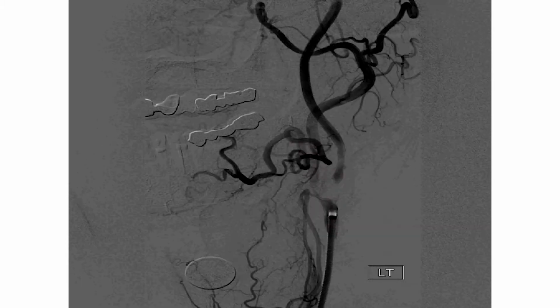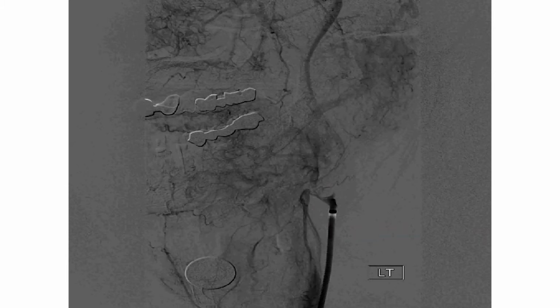Up here you have a little catheter spasm from what's called the distal protection device. So when we do these, we, again, go in the femoral artery, thread a sheath up to here, put a distal protection device, which looks like a little filter, like a windsock, up past the stenosis to catch any debris, then put up a stent and deploy it, and then an angioplasty, and then you take the filter out. So again, a very quick in and out procedure.